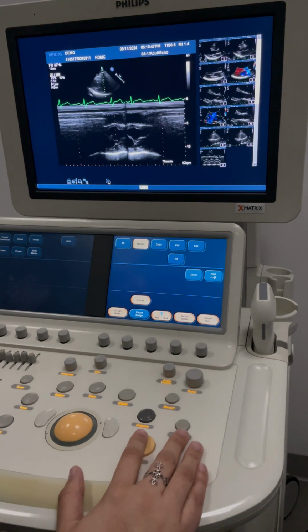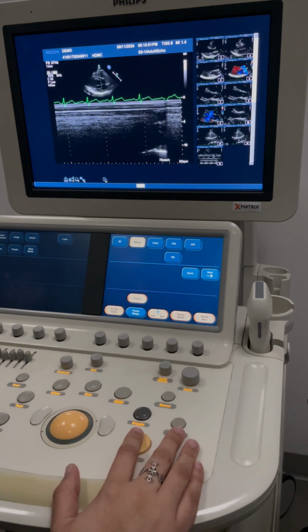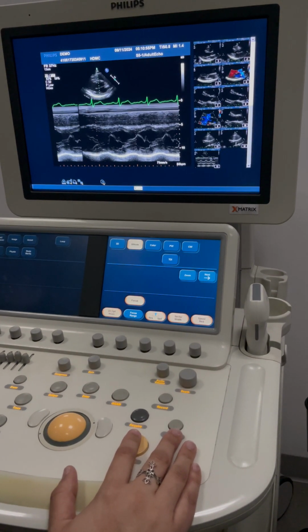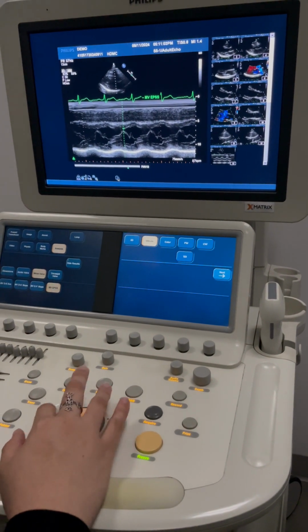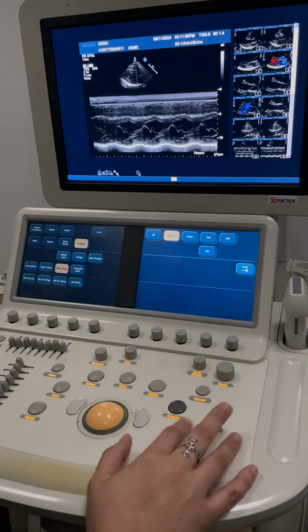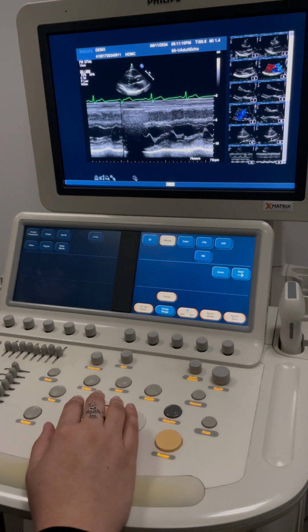Breathe in, Savannah, and then breathe all the way out. Okay, hold your breath there, don't breathe. And breathe. You're going to go to mitral valve, your mitral valve EPSS, and measure your septum to your anterior mitral valve leaflet and acquire that. We'll measure your left ventricle.